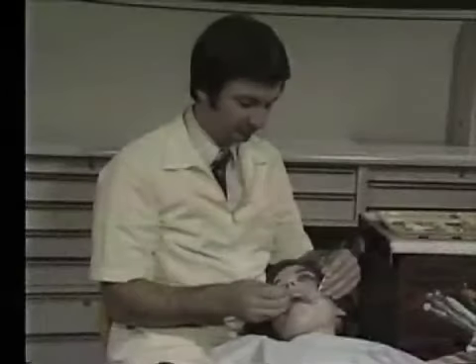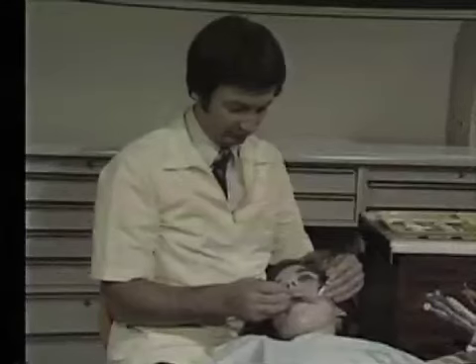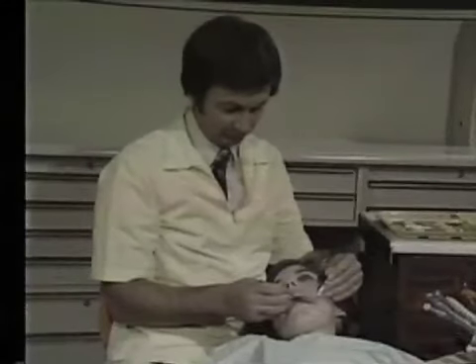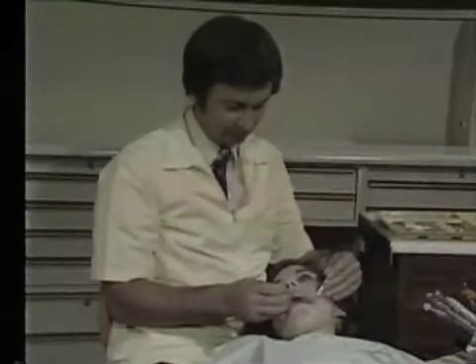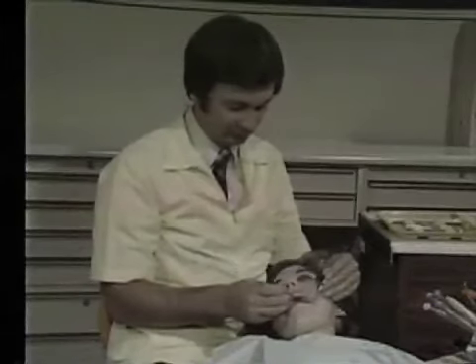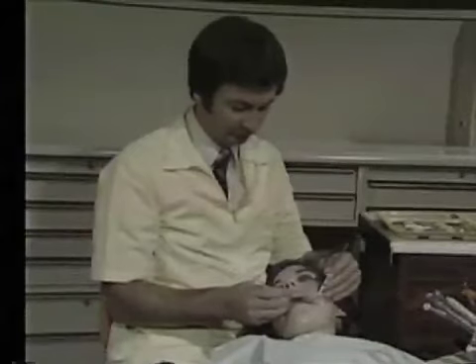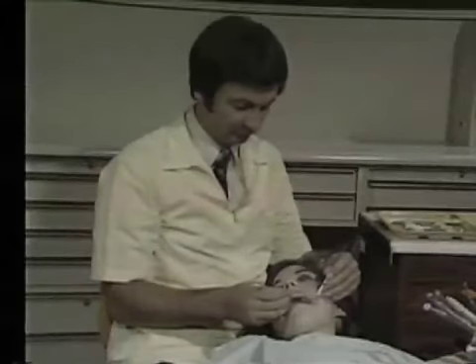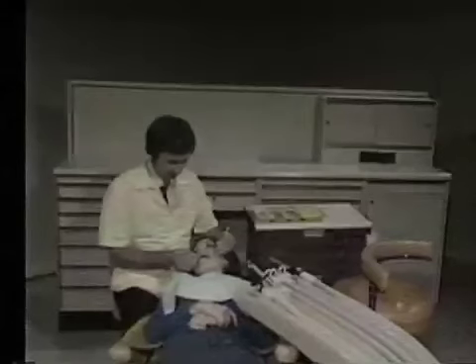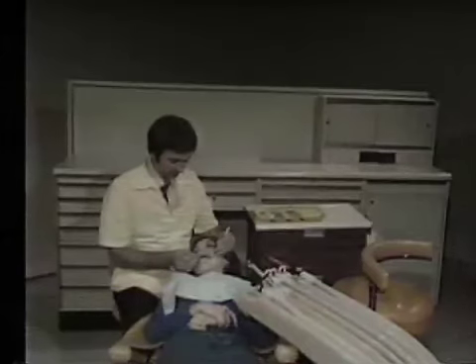Notice the oral cavity is centered in front of the dentist. A distance of 14 to 18 inches exists between the operator's eyes and the oral cavity. When in working position, the arms remain close to the body with forearms rather parallel to the floor. The upper body is upright and supported by the backrest of the stool. These relationships reduce fatigue and allow the dentist to work comfortably for long periods of time.